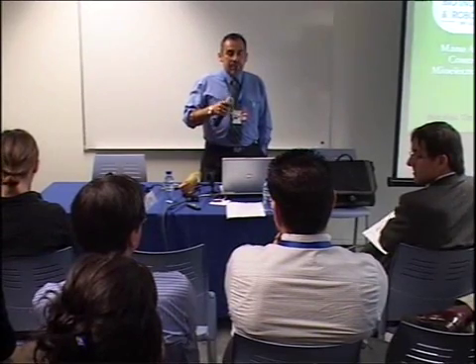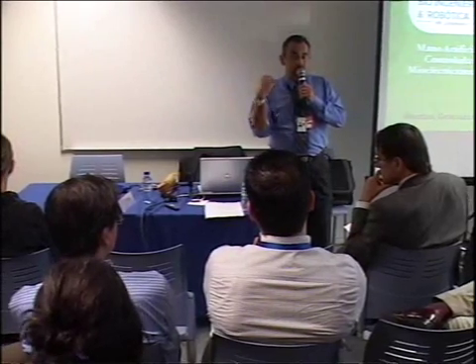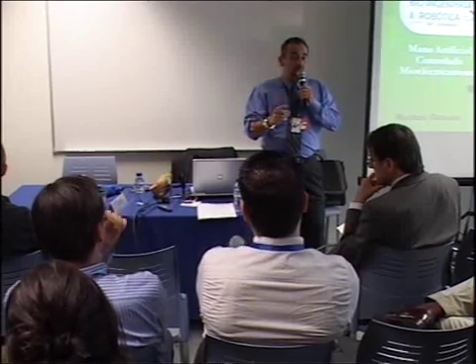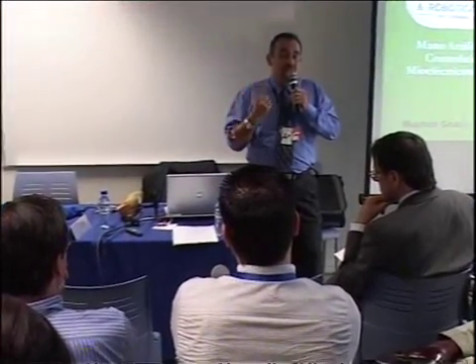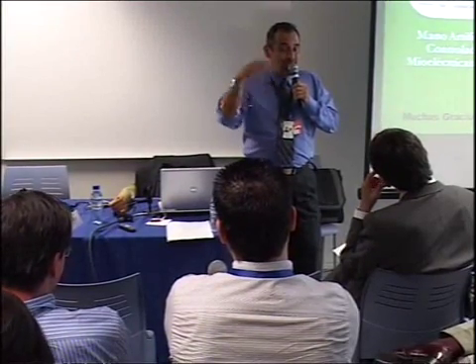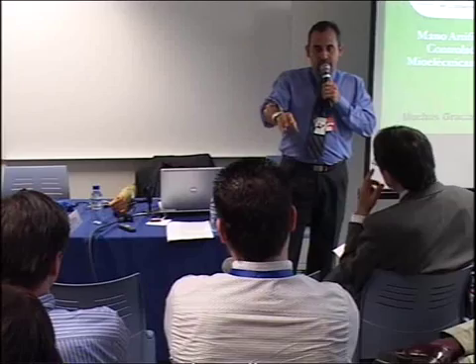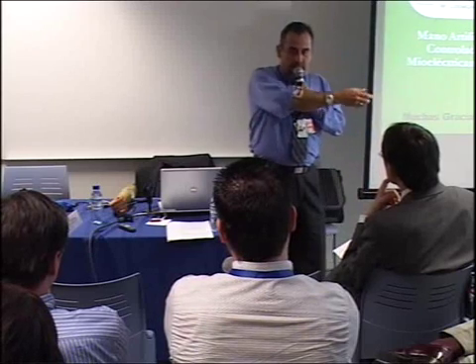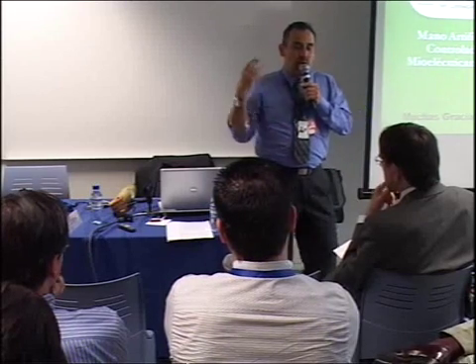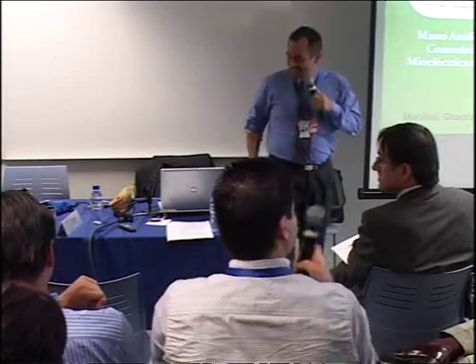Pronation and supination are possible with these hands. The idea was to use another signal for pronation and supination. Fundamentally, you need to evaluate what is more important, pronation, supination, or flexion and extension. That ought to be looked at. One thing is to do this, which takes place with the whole forearm, or this. So the signal I can obtain is in order to do this or this. Yeah, it can be done. Yes, of course.